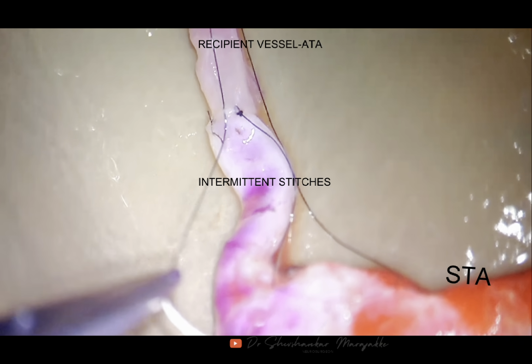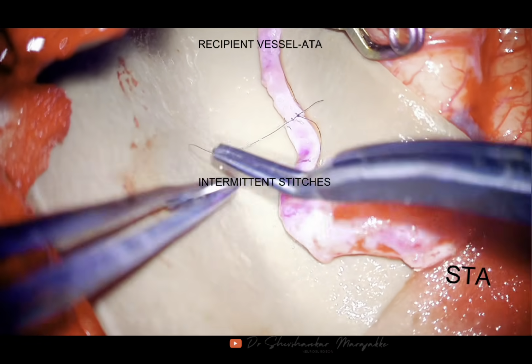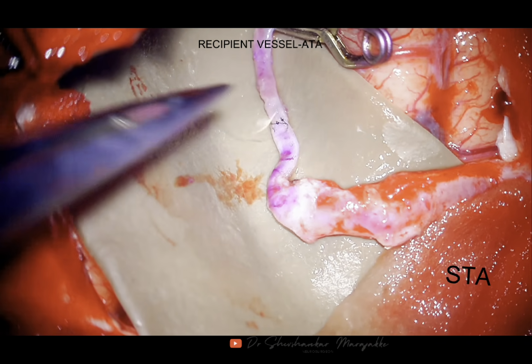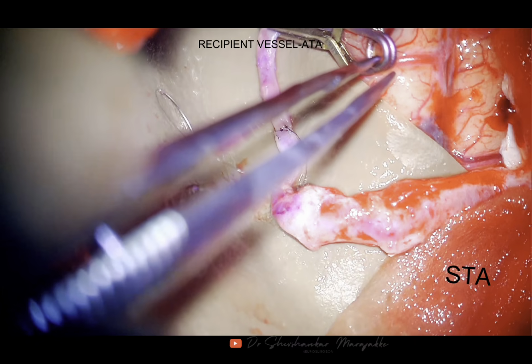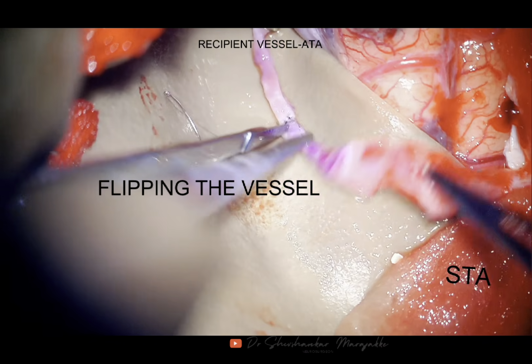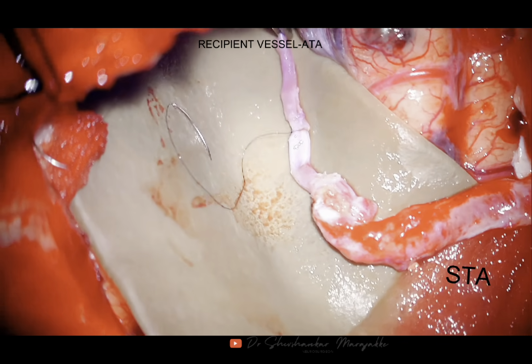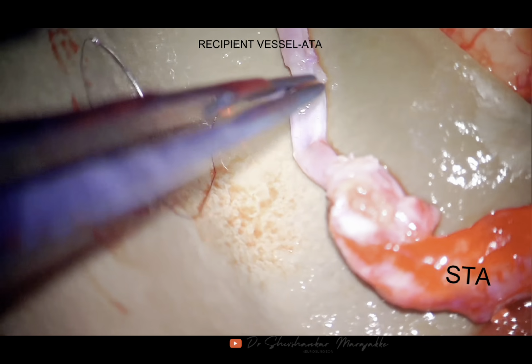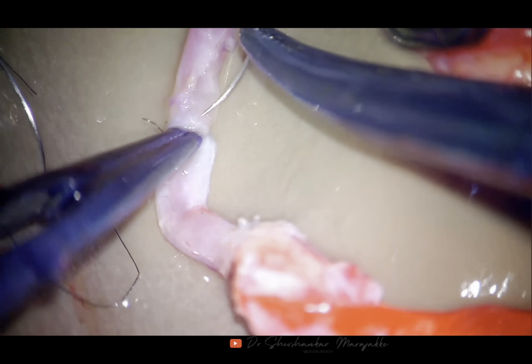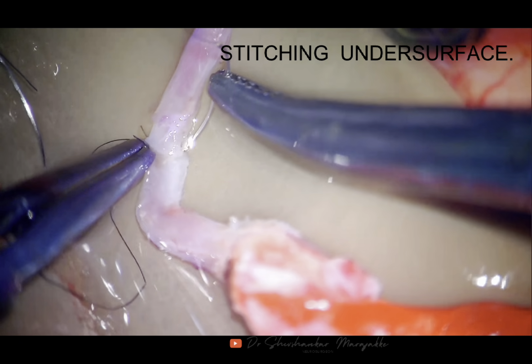As we saw, the first sutures are placed at 12 o'clock and 6 o'clock, and we are suturing in between. In this case, the shanks of the temporary clips can be rotated, as I am doing here, so that I open the opposite surface of the arc. End-to-end anastomoses need quite fewer sutures compared to end-to-side or side-to-side. If you require a dozen sutures for side-to-side or end-to-side, in this half a dozen are enough.